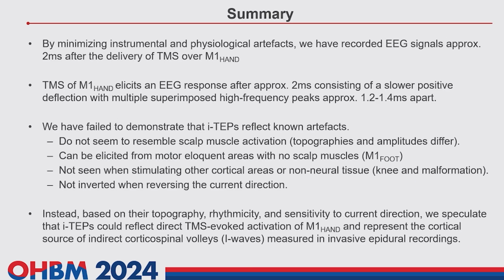So in summary, what I wanted to show you is that we have found something new. We are super excited about it because it's the first time that we can measure a response in the brain 2 milliseconds after TMS stimulation. And if this is true, that this is a cortical response, then for the first time we can see the local excitability of a brain region. We did it on the motor cortex, but everything else is unexplored.